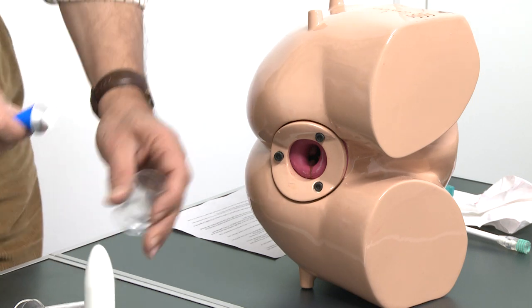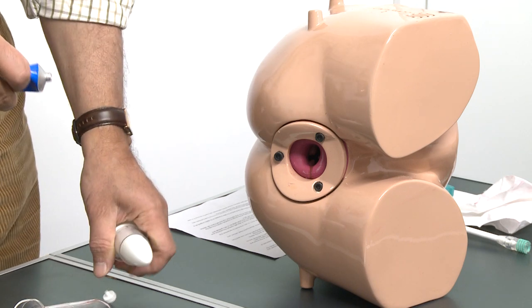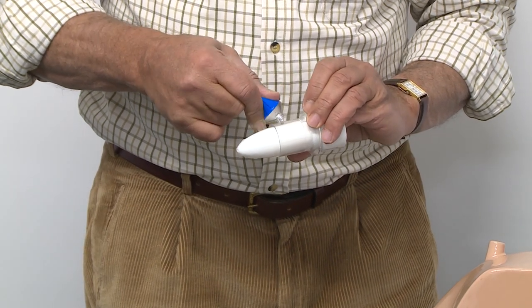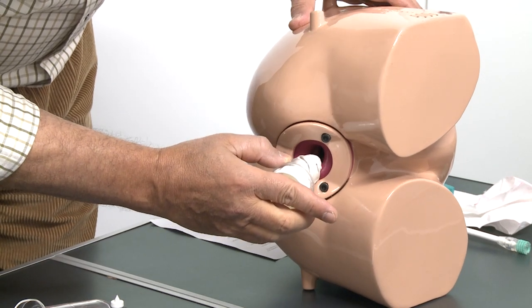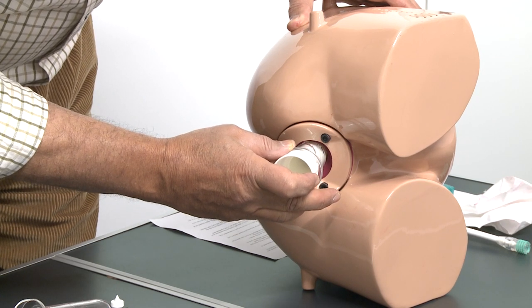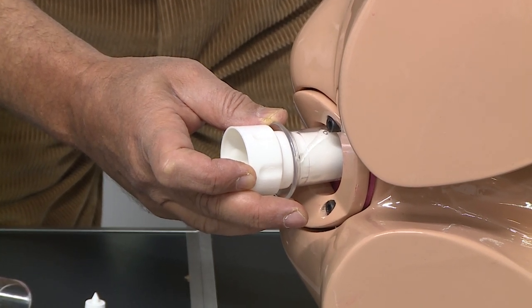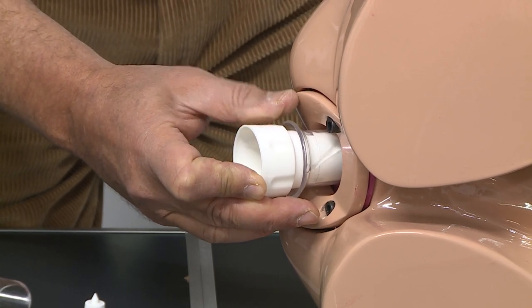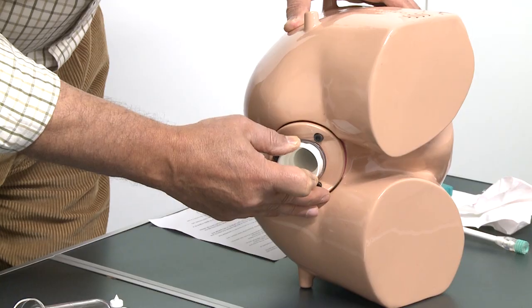We apply KY jelly liberally on the trocar and the sleeve and begin introduction with very gentle, steady pressure to dilate the external sphincter. Because patients are apprehensive and worried, they contract the external sphincter, and steady, very slow pressure is required to dilate it and reduce patient discomfort.